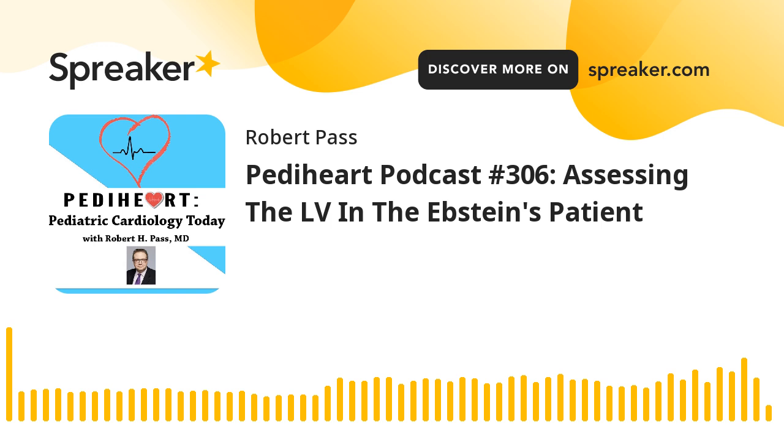So yes, that is the goal, to have this objective data pre-op so that it can be looked at post-operatively. We did have a smaller number echo-based study which looked at LV parameters just because it's so hard to get a post-op CMR since it's a referral center with a variety of local resources that patients come from. In that smaller study, we did find improvement in LV stroke volumes, but not changes in the EF, which now makes sense because probably LV EF was never picked up by echo in the first place. Yes. There was another study by the Great Ormond Street group, which was discussed at your podcast too, which looked at pre-op and post-op CMR, LV function.